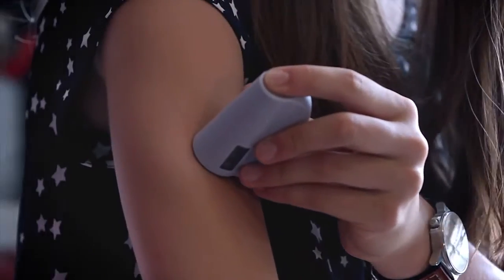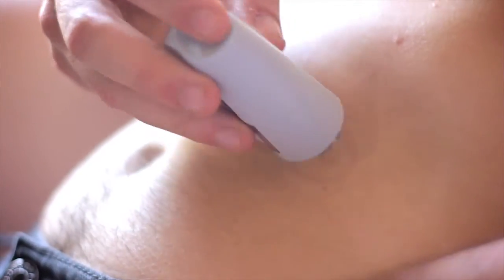Apply Zinio on the injection site. Push Zinio onto the skin until automatic triggering. With Zinio, injection can be performed into the arm, into the thigh, into the abdomen, etc., according to drug specifications.